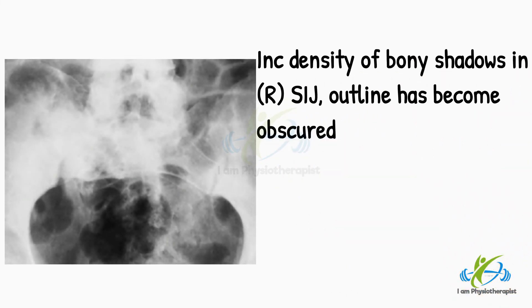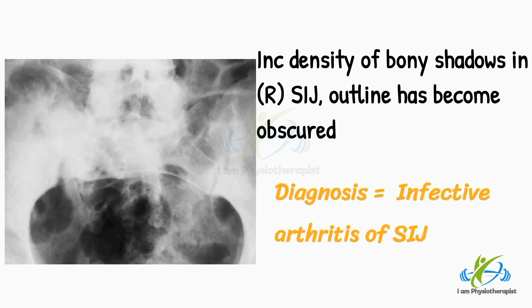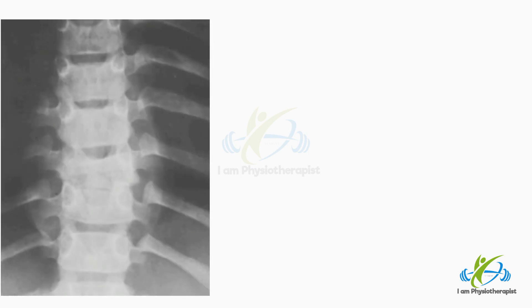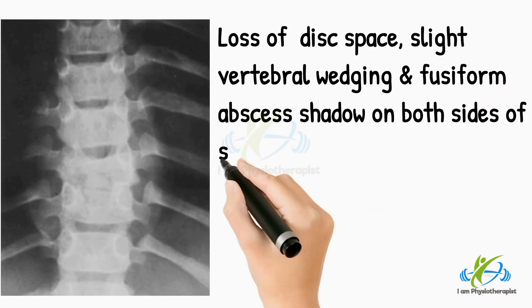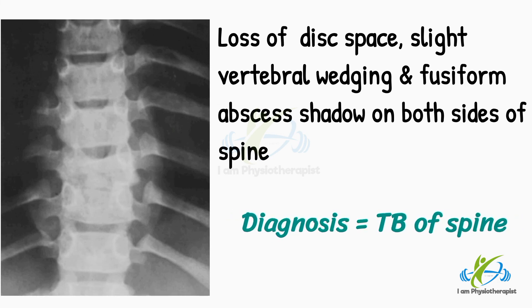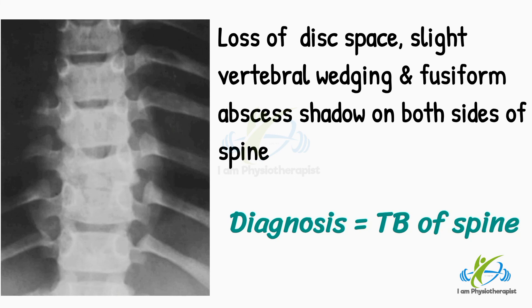In this radiograph, there is increased density of the bony shadows in the region of the right sacroiliac joint, whose outline has become obscured. There was associated local pain, malaise, and pyrexia, and attempts to spring the sacroiliac joints produced great pain. Diagnosis: the appearances are typical of infective or pyogenic arthritis of the sacroiliac joint. This radiograph is of an 8-year-old boy complaining of back pain, malaise, night sweats, loss of spinal movements, and pain on percussion over the spine. There is loss of a disc space, slight vertebral wedging, and a fusiform abscess shadow on both sides of the spine. Diagnosis: the appearances are typical of tuberculosis of the spine.